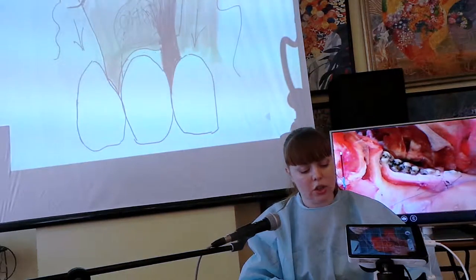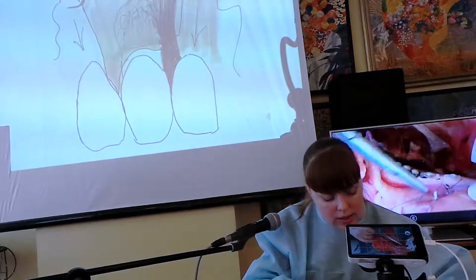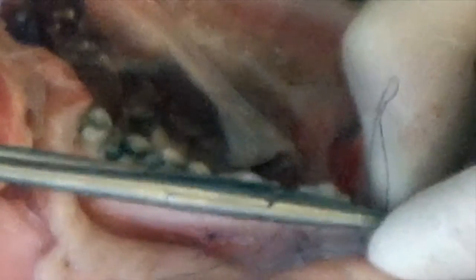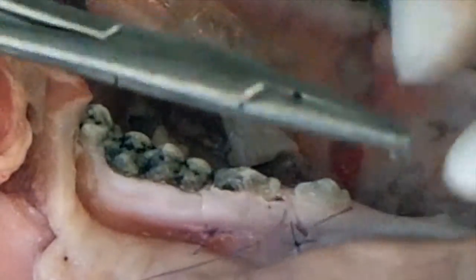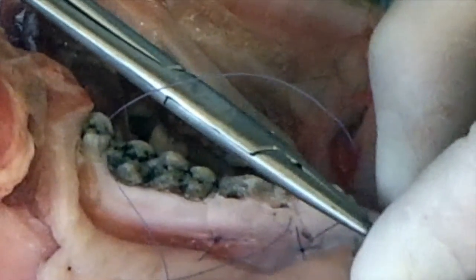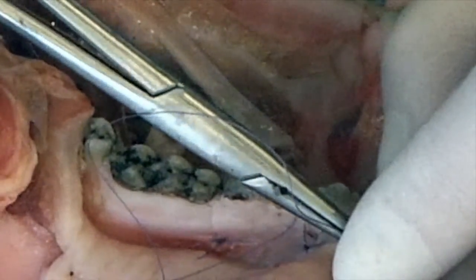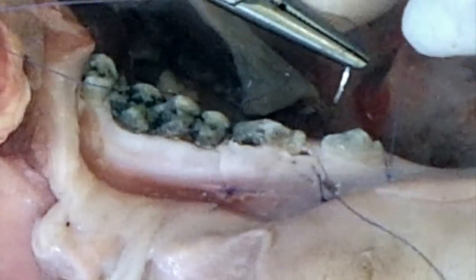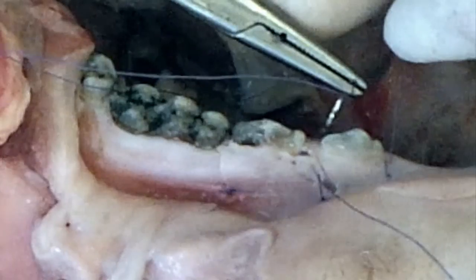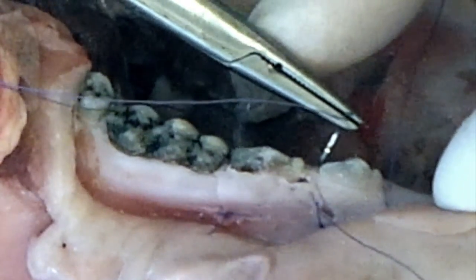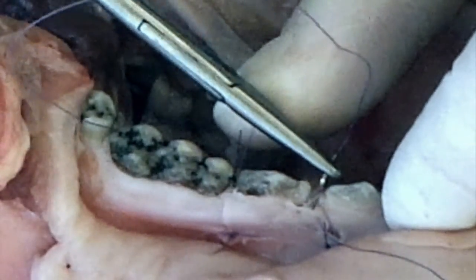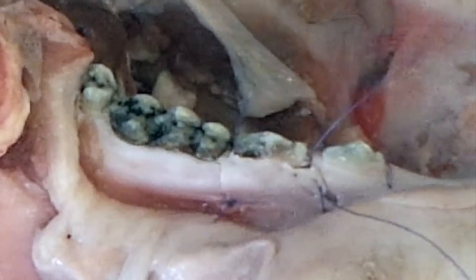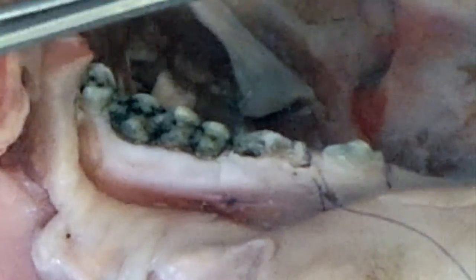Делаете вкол в зоне расщеплённого слизисто-надкостничного лоскута. Выкол с вестибулярной поверхности слизисто-надкостничного лоскута. Вкол обратно в лоскут — выполняете маленькую петлю. Выходите через деэпителизированный анатомический сосочек с нёбной поверхности, обвиваете повторно шейку зуба с нёбной поверхности, делаете сквозной вкол в межзубной сосочек и сопоставляете деэпителизированный анатомический сосочек с хирургическим затягиванием узла.